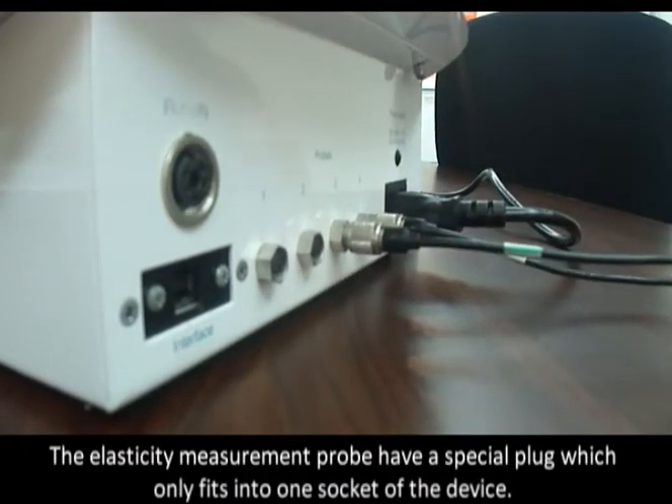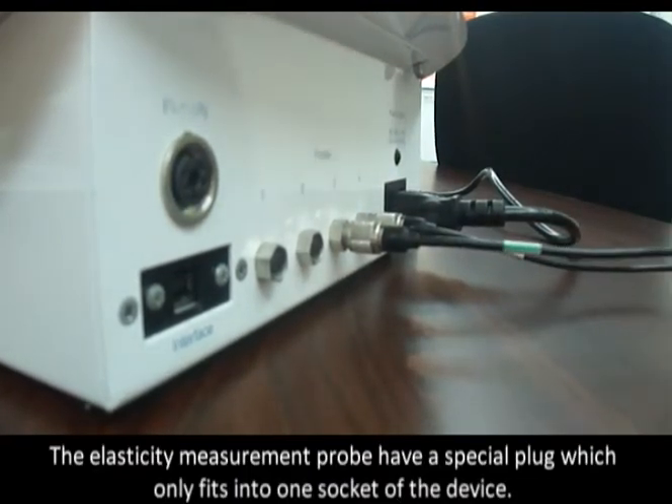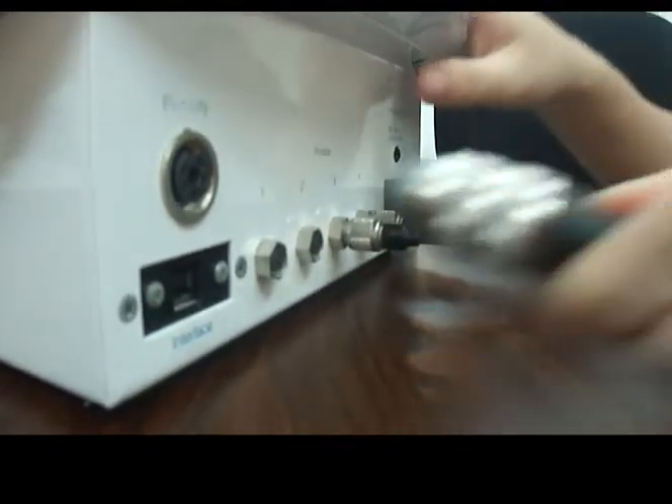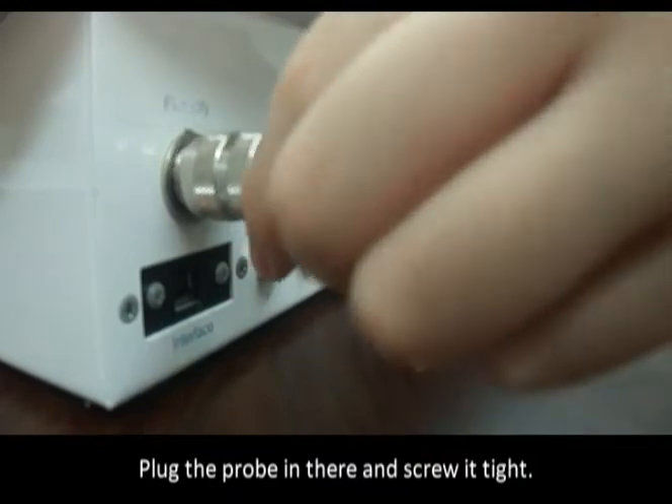The elasticity measurement probe has a special plug which only fits into one socket of the device. Plug the probe in and screw it tight.